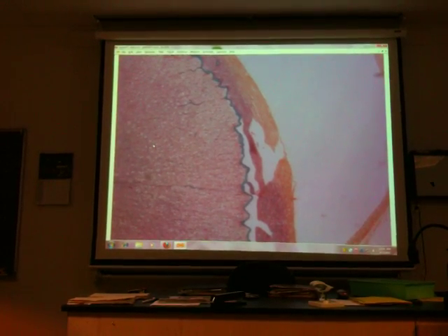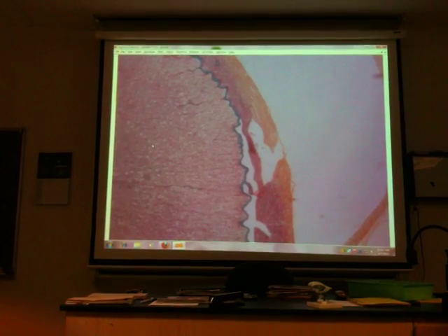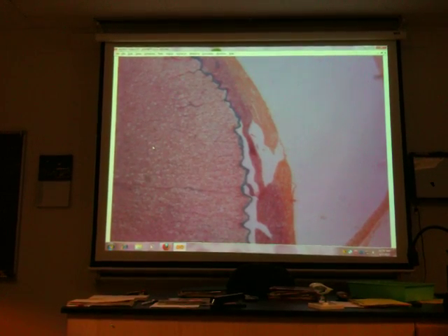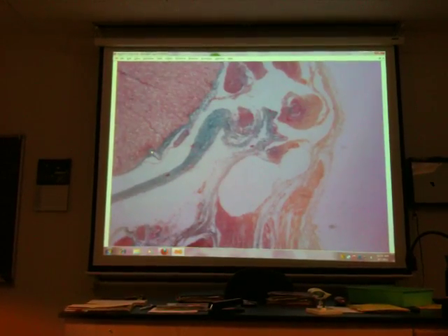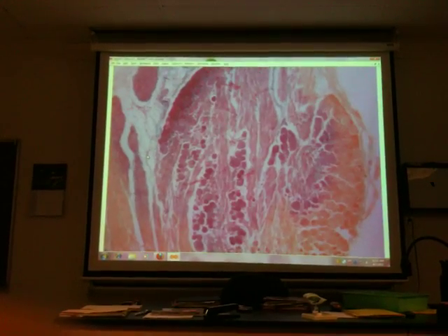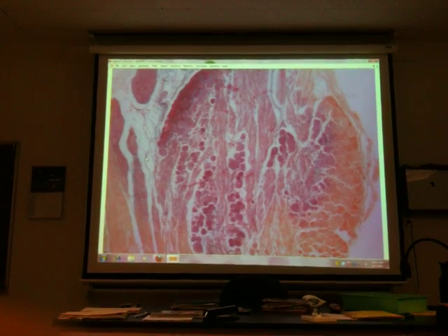Give me its function. Is it mixed fiber type, sensory only, or motor only? It's sensory only. It's a root. Only one type of fiber. So we follow it, and it's gotten busted up there again, but it leads right to this swelling. What do we call it? It's a ganglion.